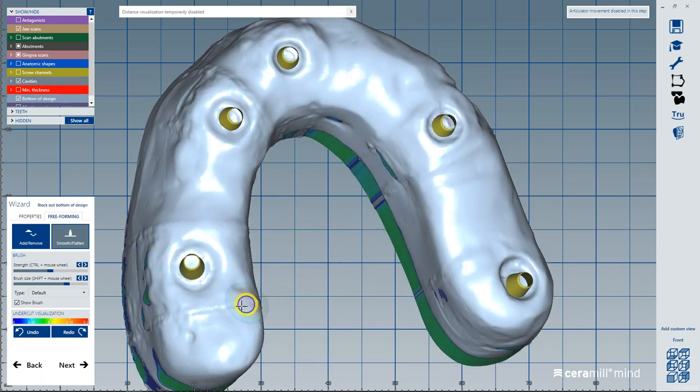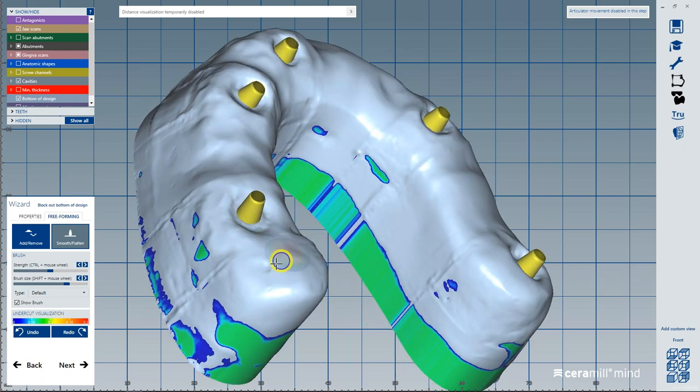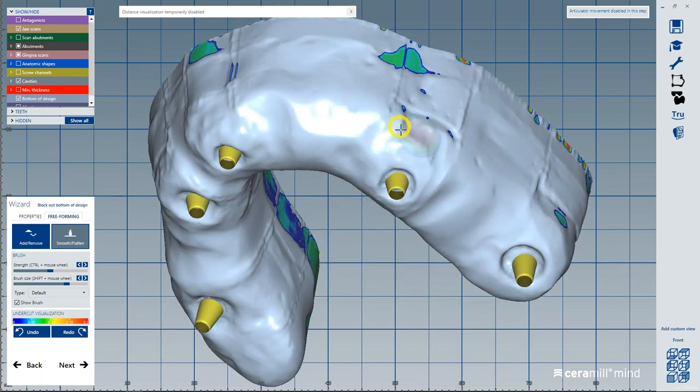anything below. So you have to keep in mind when you're designing, don't waste time on areas that you know are not going to be involved in the final restoration. For example, this rough area down here has nothing to do with the prosthesis, because it'll be here on the top part of the gingiva. Okay, that's good.